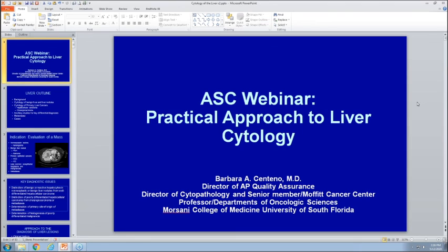Focal nodular hyperplasia is characterized by a specific blood vessel pattern and a specific appearance of the bile ducts. But I don't know that we can. I've not read any papers, or had the experience myself, of seeing that on cytology. And I do rely on microhistology to help me with that diagnosis. Yeah, I second that. That would be very, very difficult.